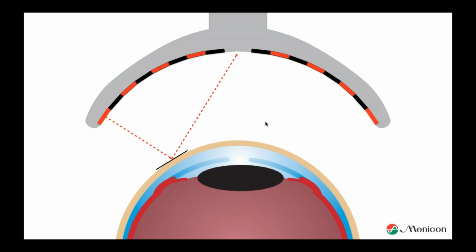This image also shows the fact that if we do topography, we have to do it in complete darkness. And why? Well, you can imagine that if there is a light bulb over here and it reflects in the eye as well, the topographer is, well, sounds rude because it costs thousands of euros, but it's a very stupid device.